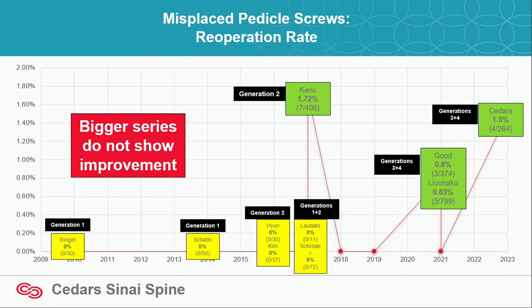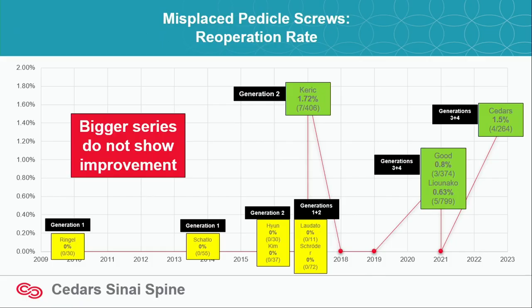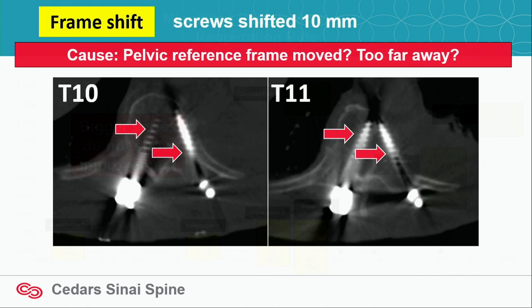And if we look at the Medtronic robot, they had now different generations. And one would think that with each generation, it gets better and safer. But what's interesting, the reoperation rate for misplaced screws seems to be getting higher over time. Now, why would that be? Well, if we're honest with ourselves, when people first start using a robot, it's marketing, it's cool, they're on stage, look at me. And they want to, unconsciously or consciously, say how good it is and get more speaking gigs and more patients. So there may be a little bit of bias that the people that are initially publishing on the robots are the people who are developing them, and it makes everyone look good together.